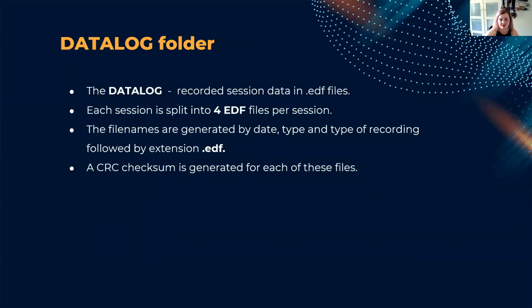Now, the DATALOG folder contains high resolution graph data records, and it's information about the airflow of the device. It also contains annotations and notes on whether or not events have taken place. If an event has taken place, it is recorded in a .eve file, which is the events file. This is an annotation that is used to determine whether the patient suffered any events like hypopnea, apnea, obstructive apnea, or central apnea. So it's about whether any adverse events were noted and the machine responded to them.